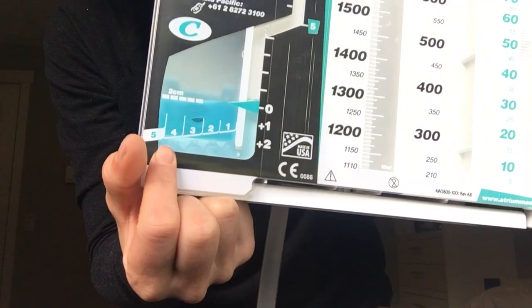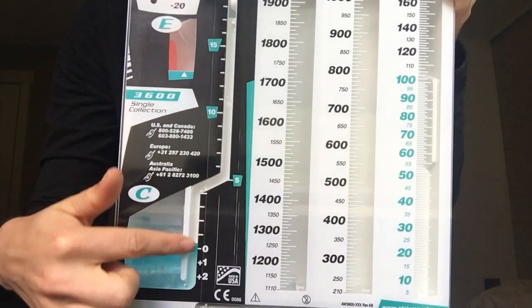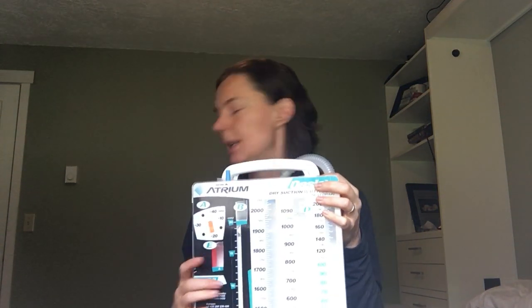A large air leak is when you see bubbles all the way over to these higher numbers, and a small air leak is when you see the bubbles just over here. Tidaling: sometimes when your patient is on water seal, not on suction, you'll see the fluid in here go up and down as they breathe in and out. If you see it, you can chart it. If you don't see it, you don't chart it. There's not much else to that. It is informational and helpful to the doctors, but it's not something to worry about or to page about.